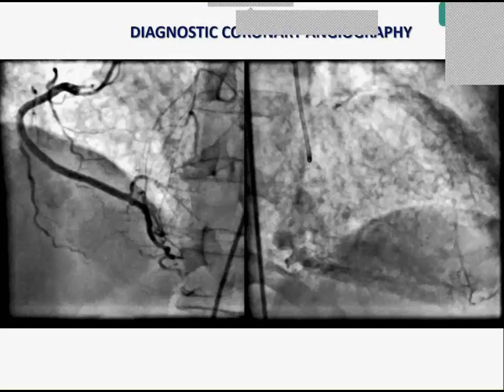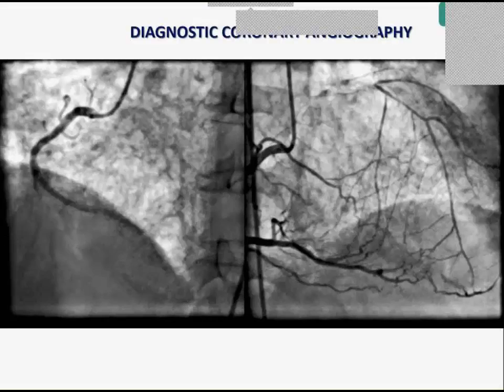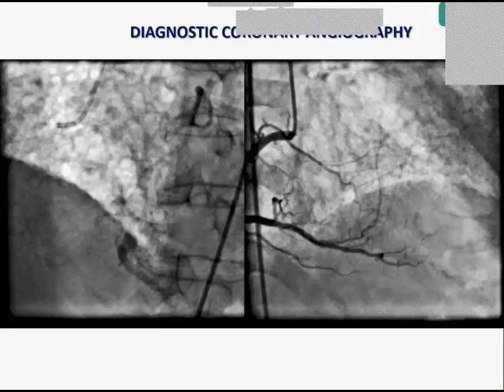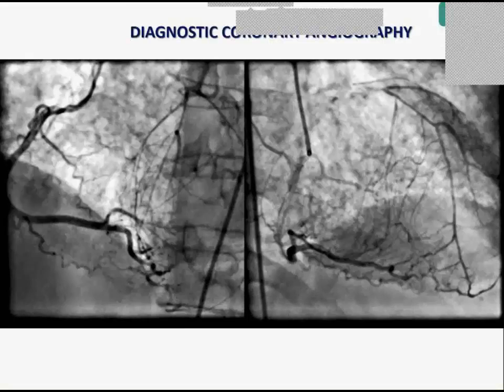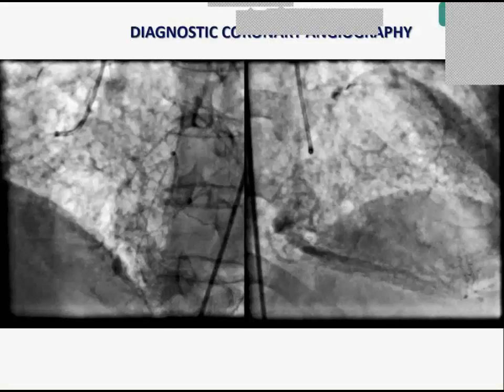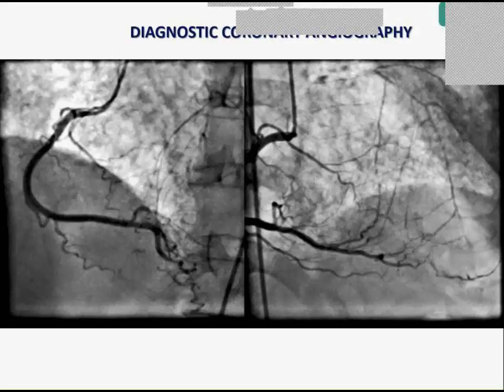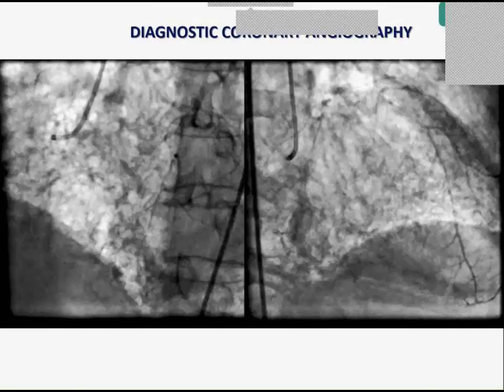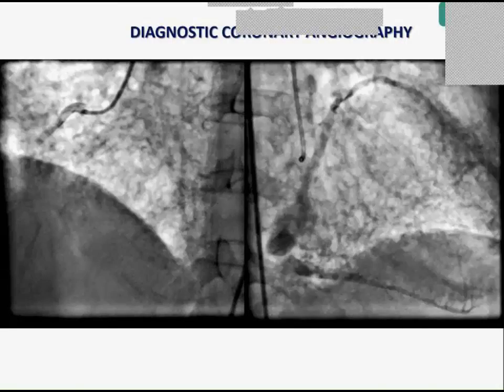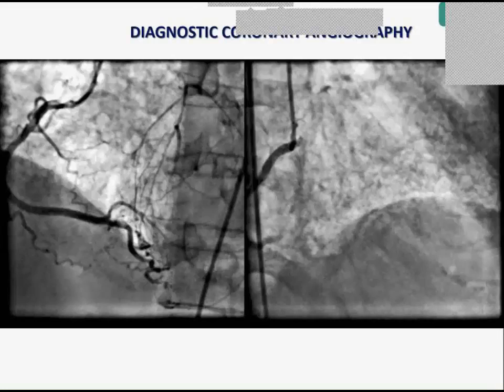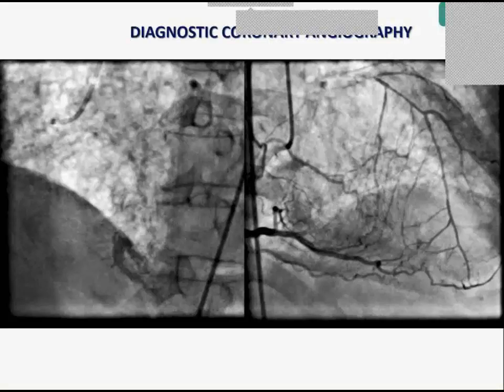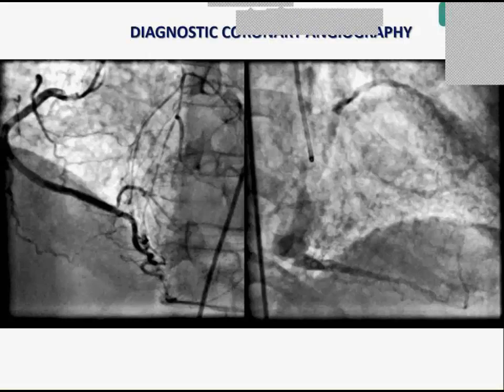After some discussion, they signed for percutaneous coronary intervention. In the United States, people really like to do bypass for these lesions, although that is changing with the EXCEL and NOBLE trials. For this case, looking at the proximal cap, distal vessel, and lesion length — it looks like a great distal vessel with excellent collaterals from septal and epicardials. So this looks like a favorable lesion to approach, though we haven't seen the left main yet.